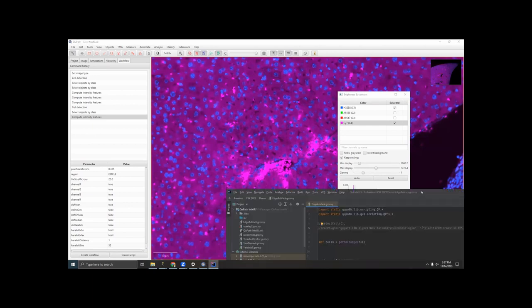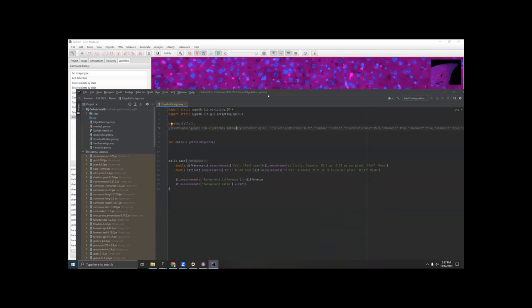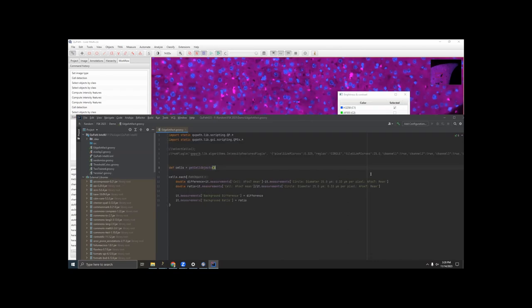So if we wanted to change that in the script, what we could do is go back here and everywhere it says 647, delete that, write in the new channel name, and just do that over and over for every channel. But that can get annoying and is very error prone. If you miss any of the spaces or any of the capitalization or anything, it's going to throw an error. So instead, I'm going to try to just use string processing to do it in a slightly more efficient way.